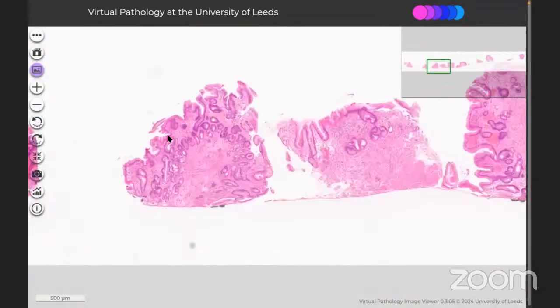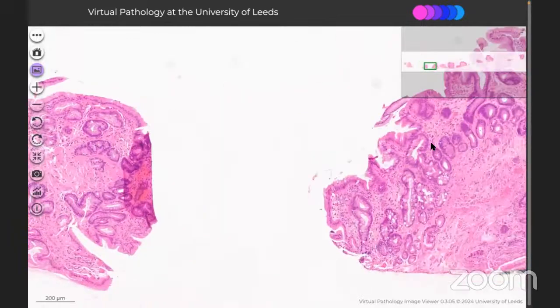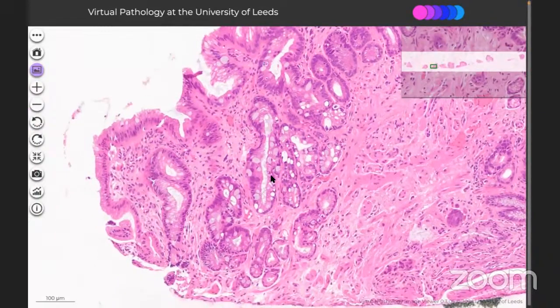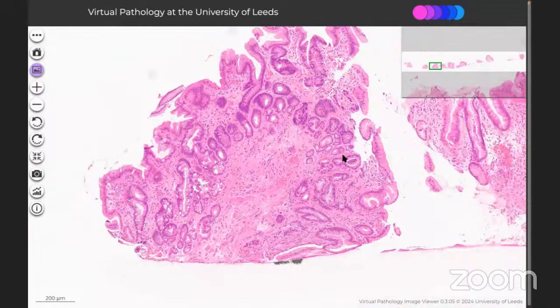The columnar lined esophagus or CLO is also termed clinically as Barrett esophagus. So again this is another area of intestinal metaplasia. So these are the adjacent intestinal cells. So I suggest that this biopsy suggests a possibility of Barrett esophagus with low-grade dysplasia.